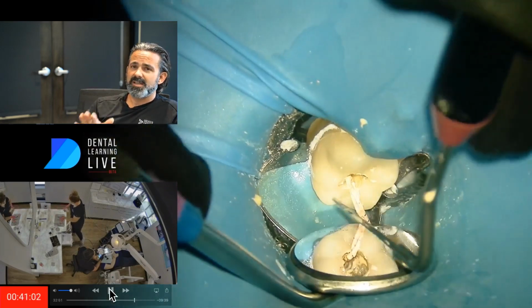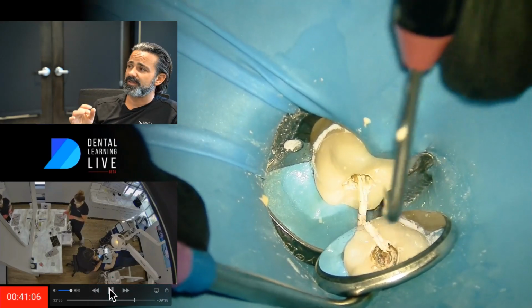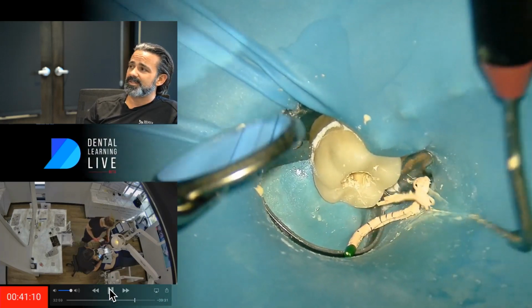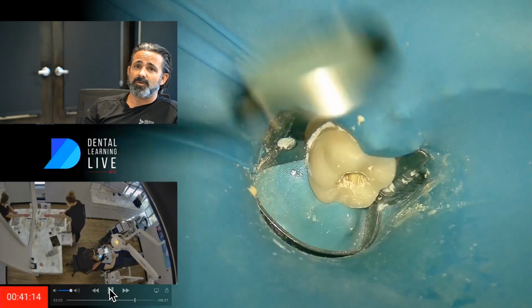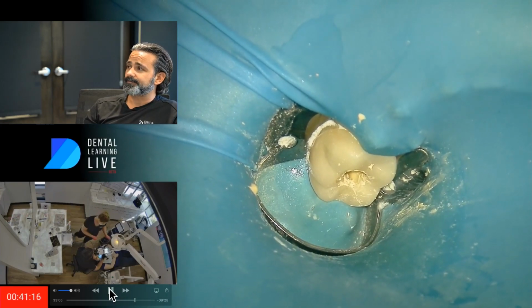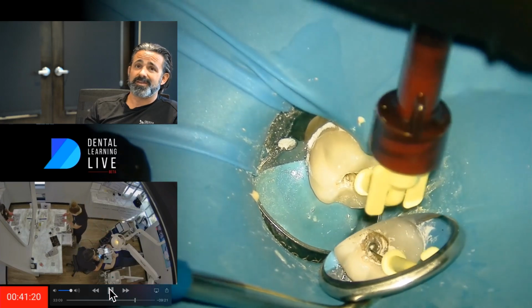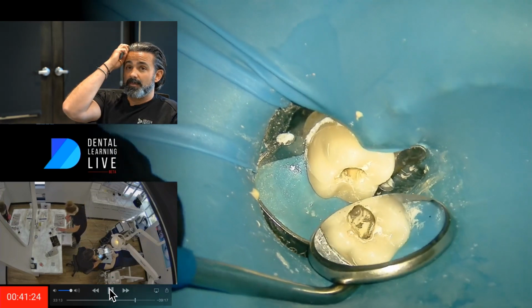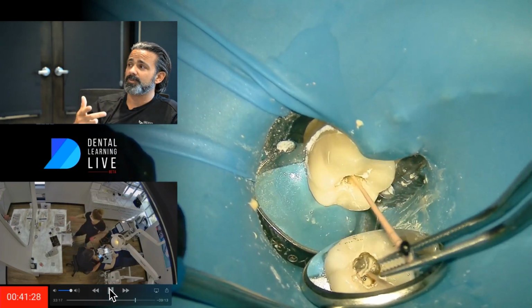Because I knew that, I didn't want to push anything out either, so I'm being a little bit gentle with it. And sometimes when that happens, you can pull your cones if you didn't really sear it out like that. So now I've got to put a new cone in. When that happens, I have a choice: do I refit, re-x-ray, all those steps that we had, and remake the new cone, because this was a trimmed cone?